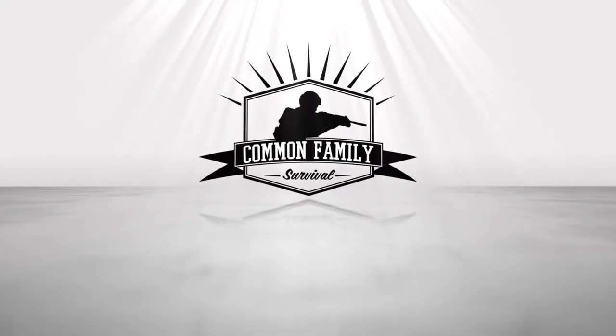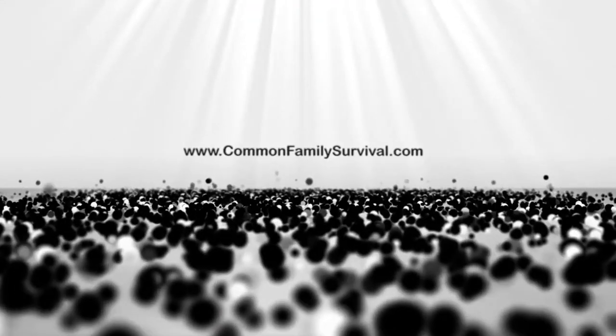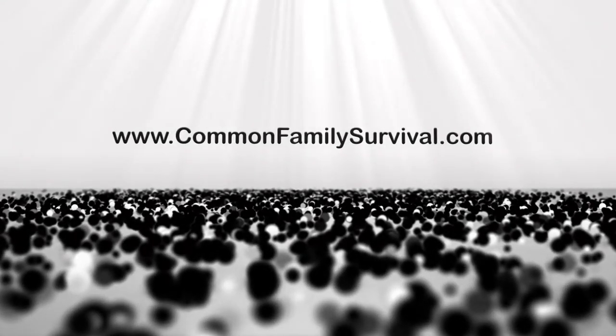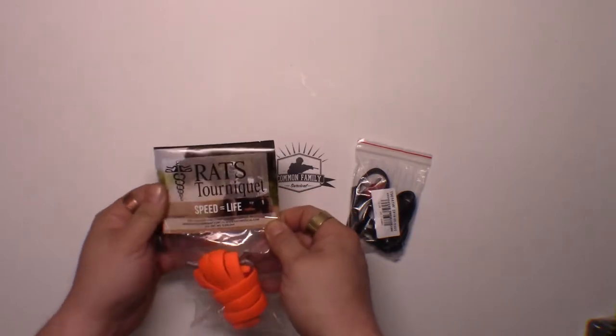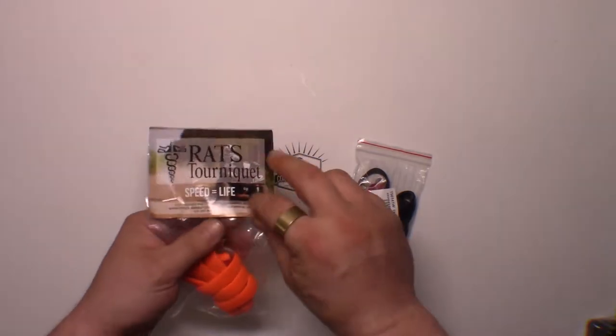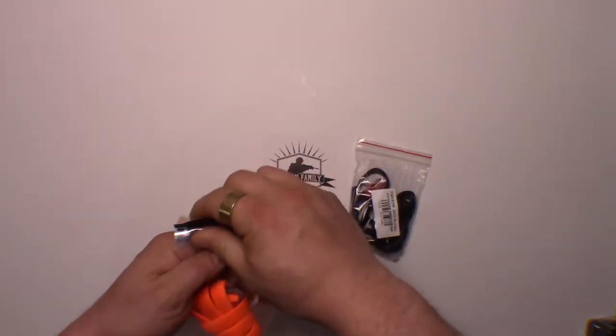RATS tourniquets - real versus Chinese reproductions. Let's check out the differences. Recently I got this in a Spec Ops global box. This is a real RATS tourniquet.